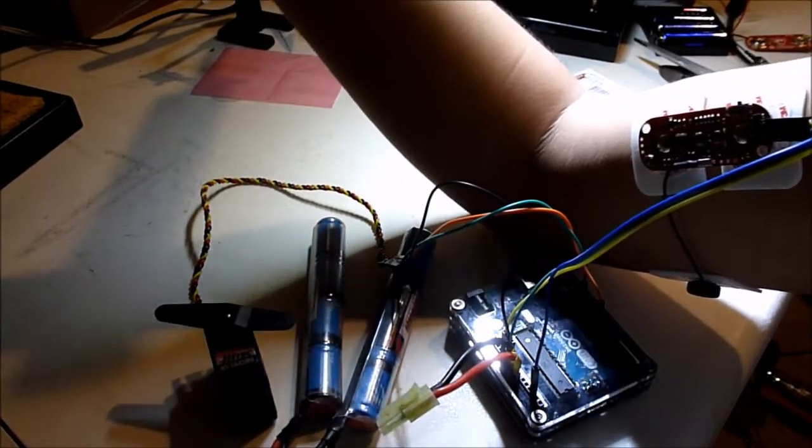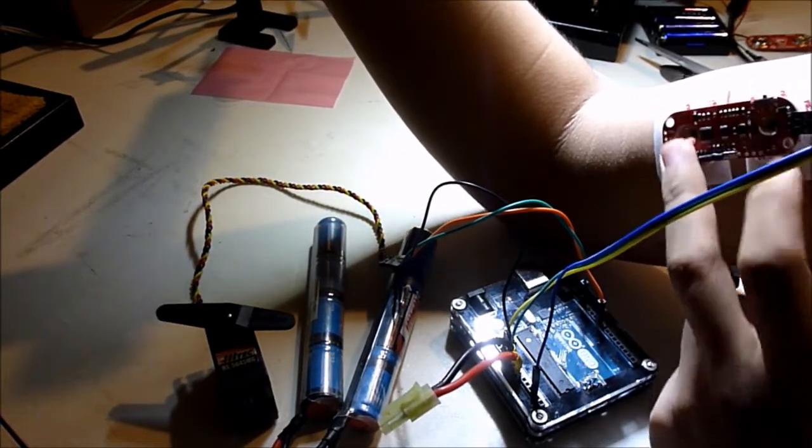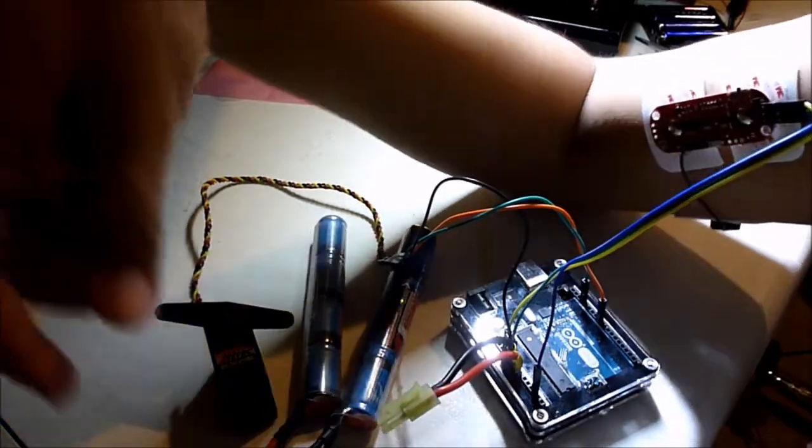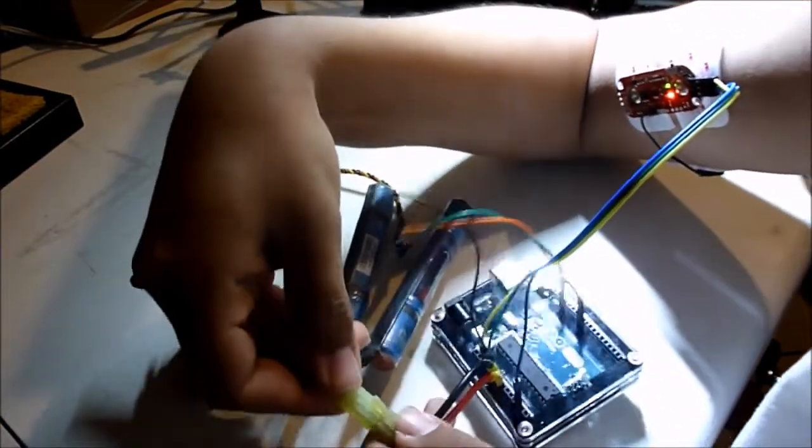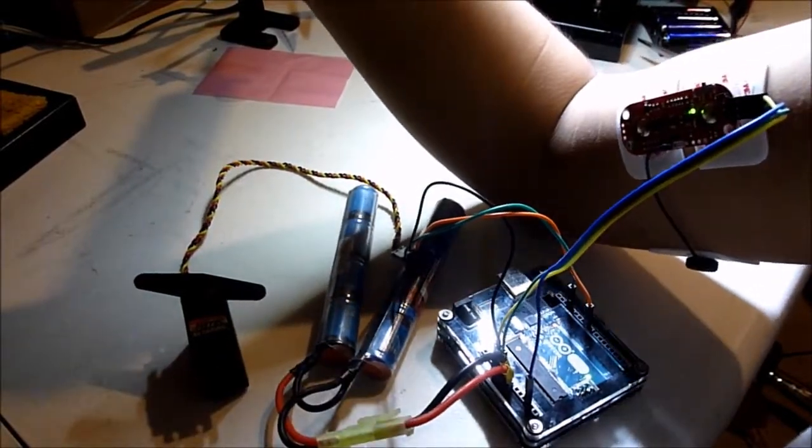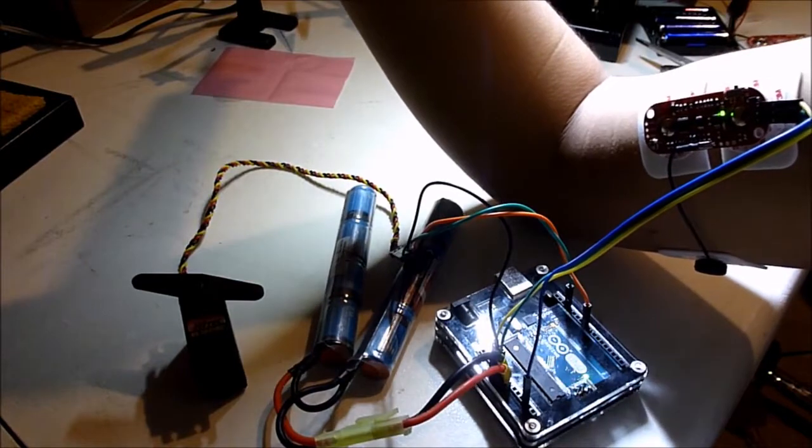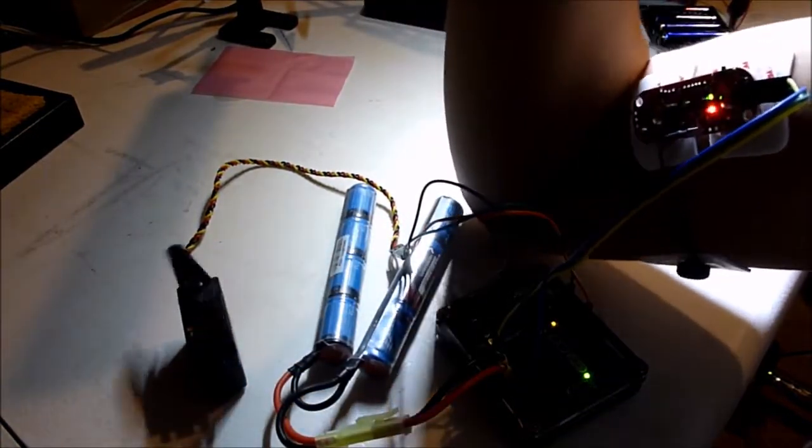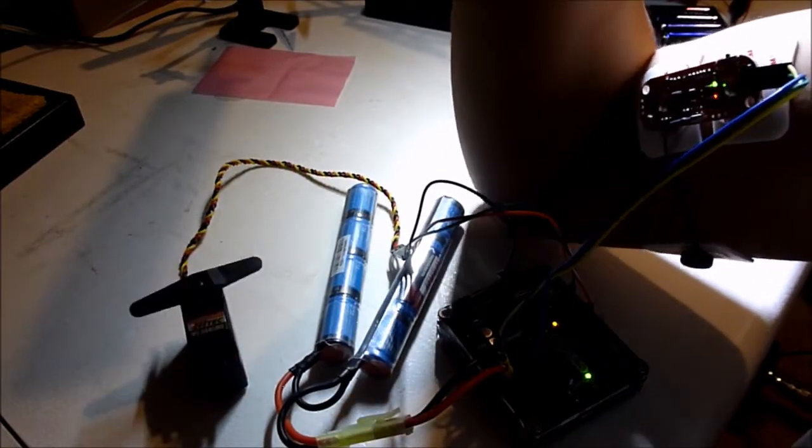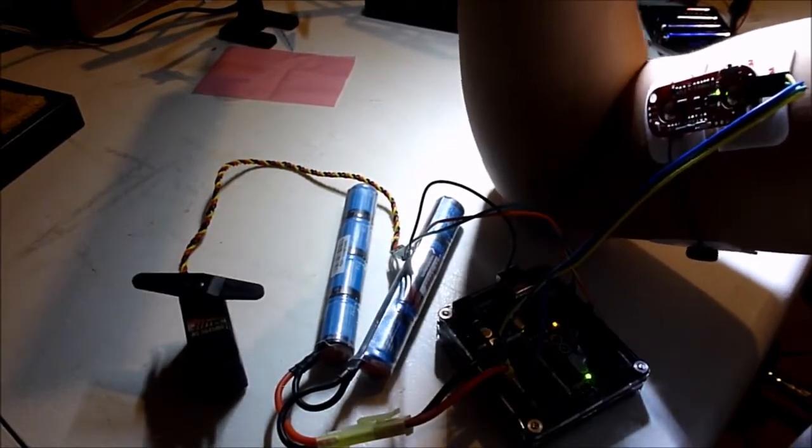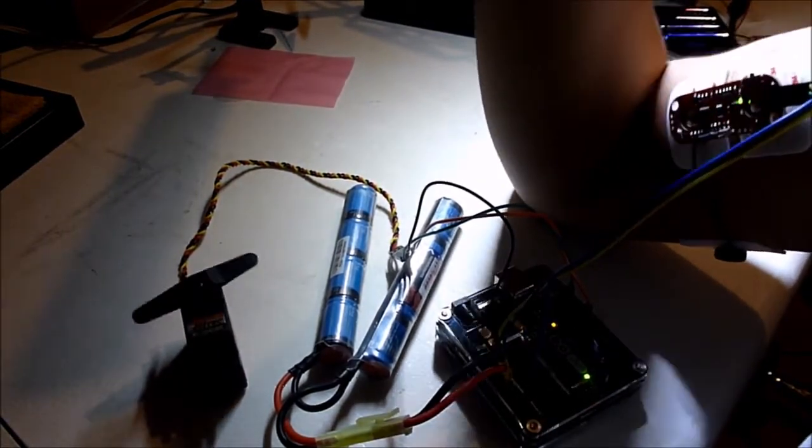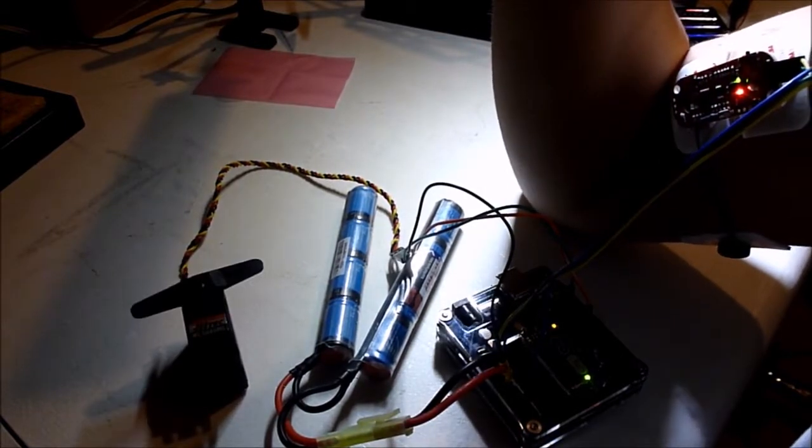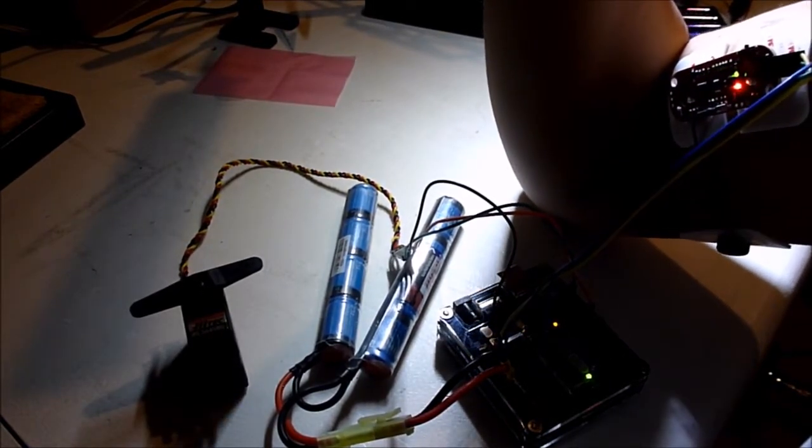Now, the final step is to attach the Myoware to your bicep, or whatever muscle you prefer, and then attach the battery to the battery adapter. Now, whenever I flex, the servo will move. I can even hold the servo to its max position.